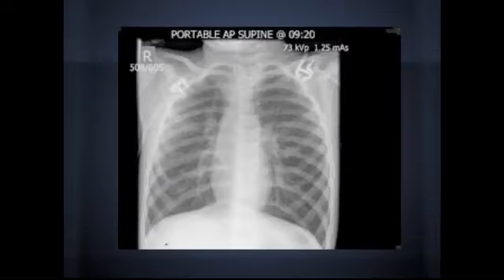Okay, so we have our asthmatic on the vent. We've tried to adjust the settings to maximize exhalation time as needed. We've reviewed our waveform on the monitor. But what if our patient starts crashing? What if they start becoming hypotensive?